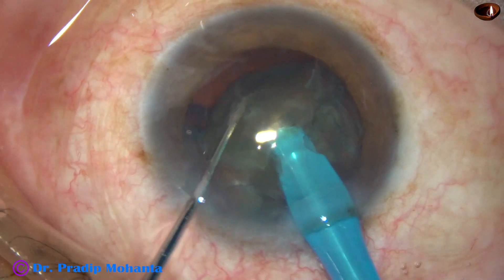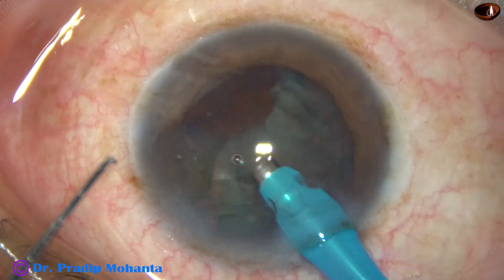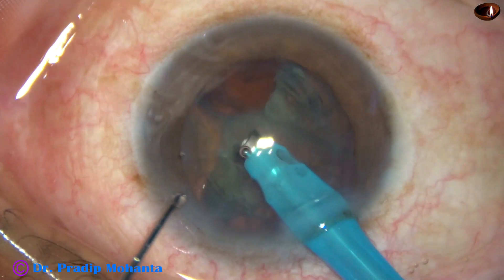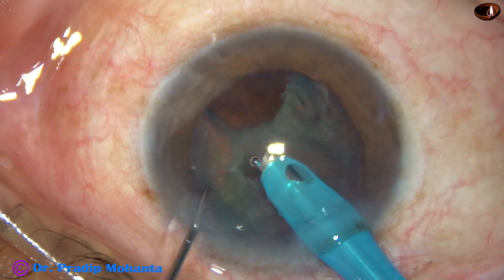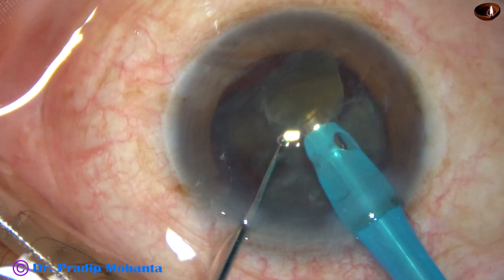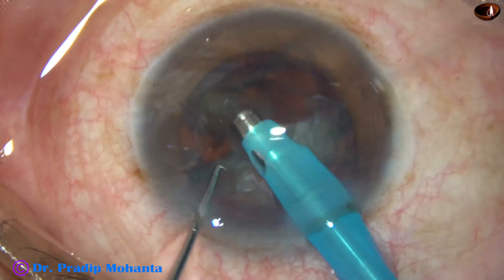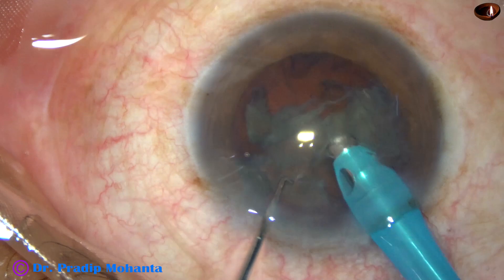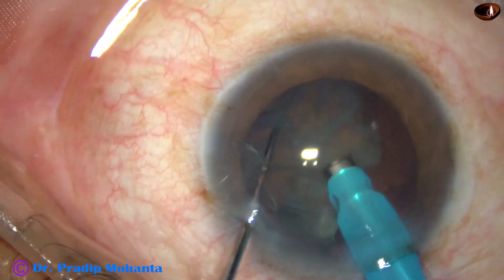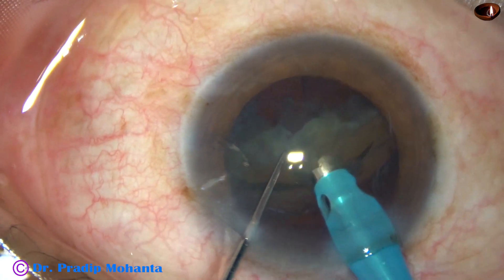By this time two incisions have been made — one main incision and one side port on the left side of the main incision. Trypan blue has been injected underneath an air bubble. The dye is washed out using BSS, balanced salt solution, and then 2% hydroxypropyl methyl cellulose is injected into the anterior chamber.